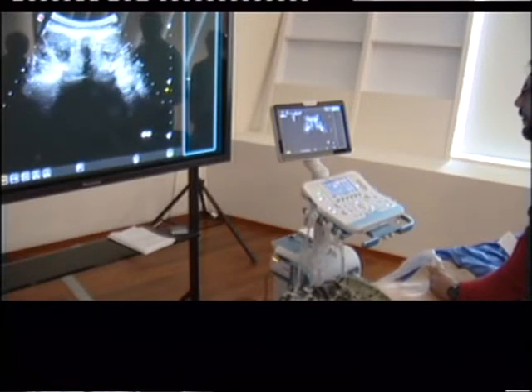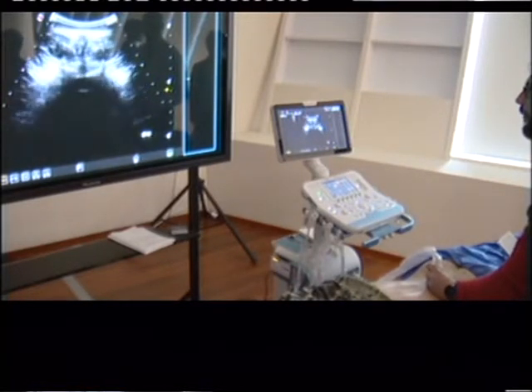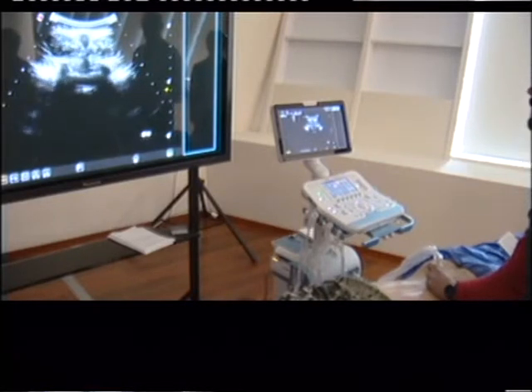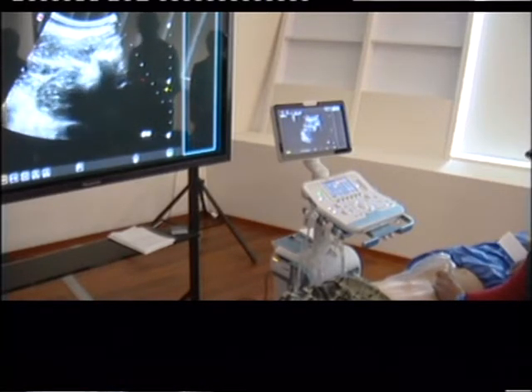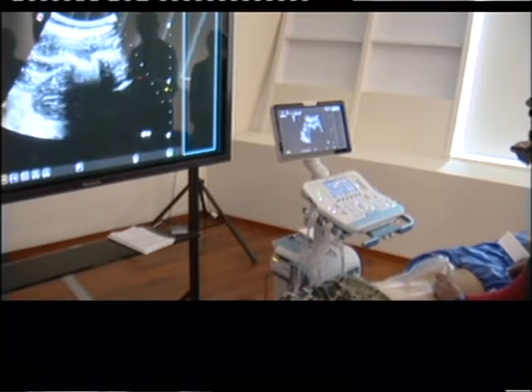Now go to 3. Up. 3. Keep going up a little bit, a little more. That's a facet right there. All right. Now go lateral. There you go. So here's my W. Up. Now. There. Perfect. And the facet. And then spinal cauda equina.